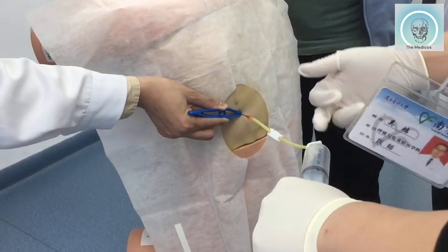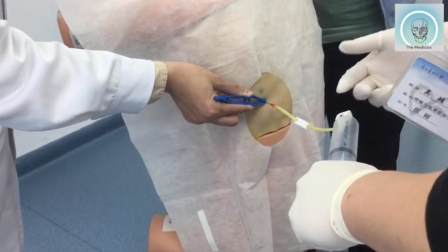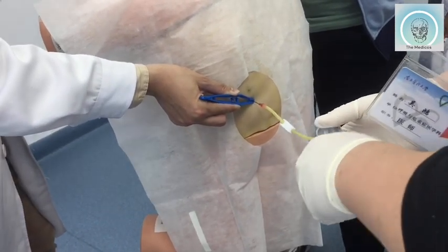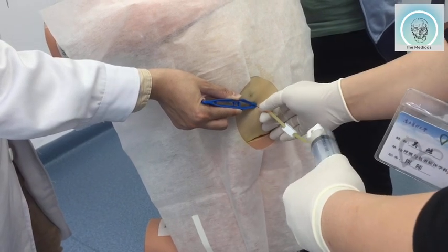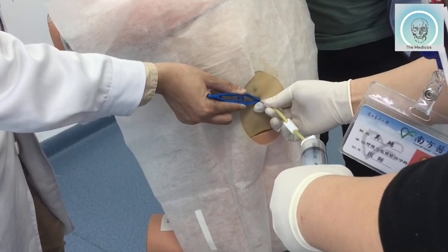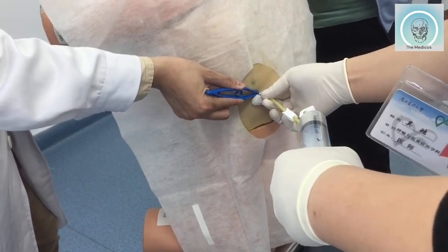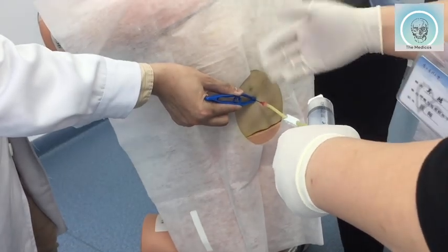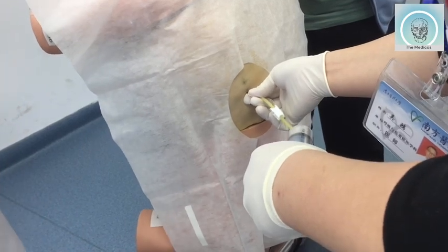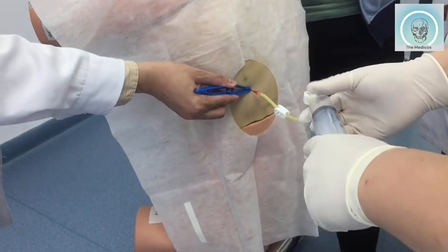There is some, you can see the air or sometimes the liquid coming into the syringe. But sometimes you find pulling back is very hard for me. You can hold this and work in slowly until you can see the fluid or air come into the syringe, and stop it. Okay. And so you can see and stop it and ask the assistant to hold it again.